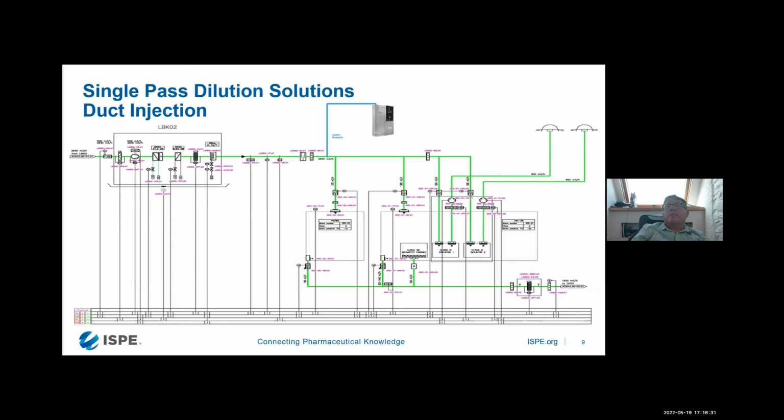Great. I think Nicholas has answered a couple of questions from Devu and Sujana. So the next question will be from Fatkul Koma. How long does it take to decontaminate a 120 cubic meter room from setup stage to completely finish, the room ready for service? If it's a single pass system of 120 cubic meters, I would say, conservatively, less than 3 hours. So less than 3 hours, you can make a complete decontamination, from the beginning till the time you can re-enter the room, roughly.